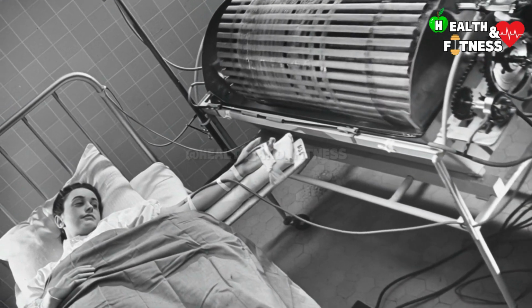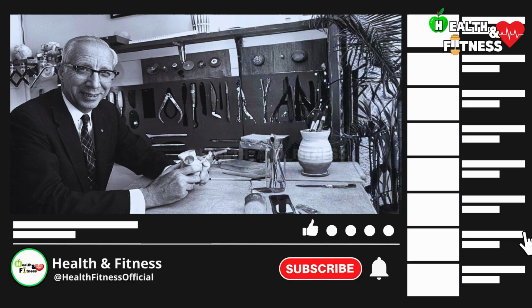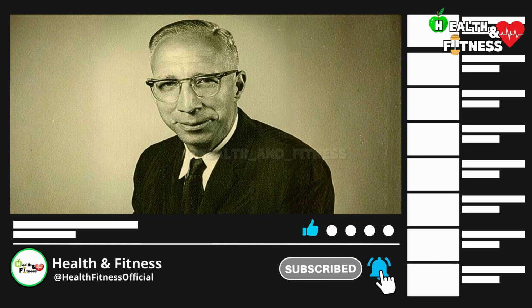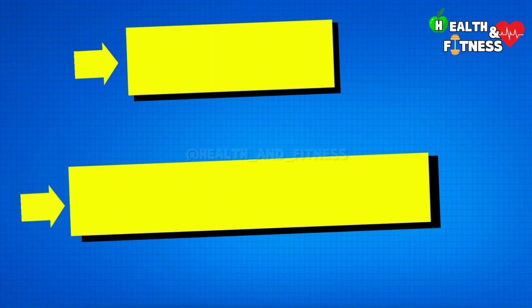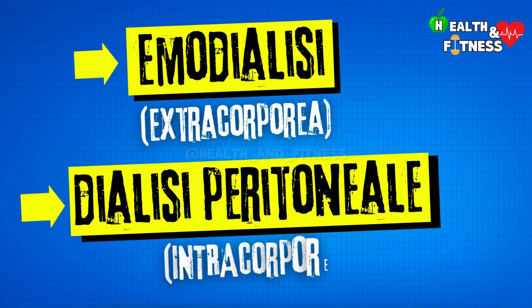Introduced in the mid-1940s, but becoming common practice in the 1960s, the invention of dialysis is attributed to Willem Johan Kolff, a Dutch-born American physician and one of the leading figures in biomedical engineering. There are two main types of dialysis: hemodialysis or extracorporeal dialysis, and peritoneal dialysis or intracorporeal dialysis.